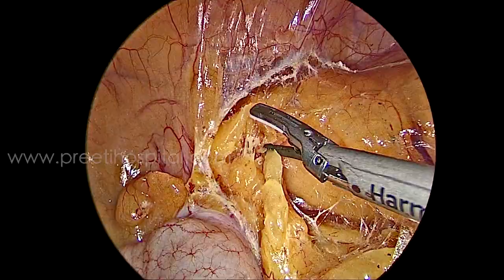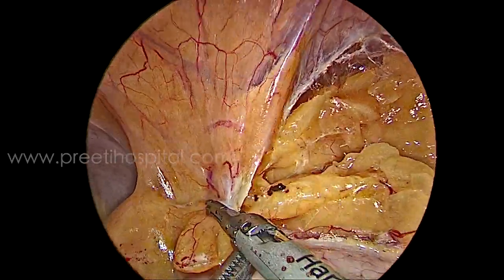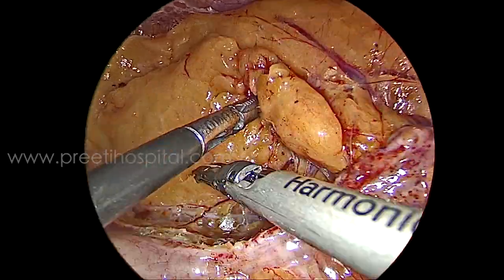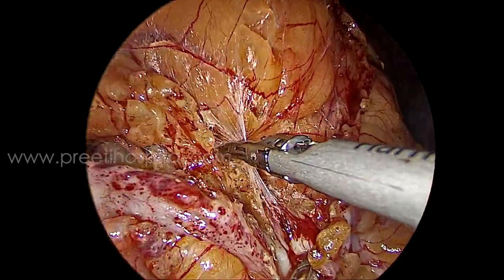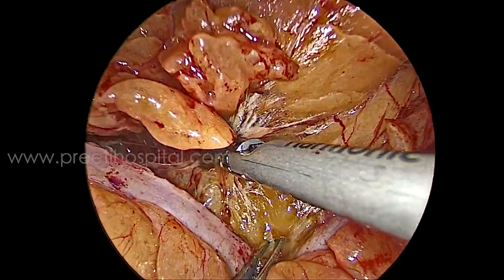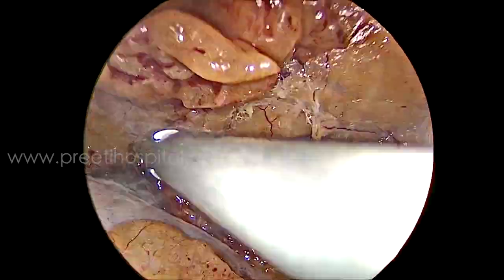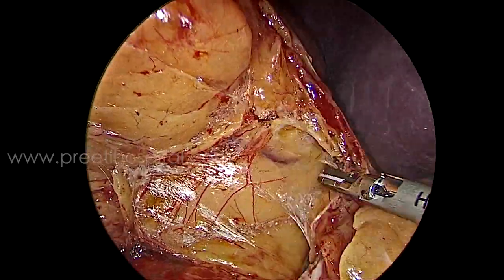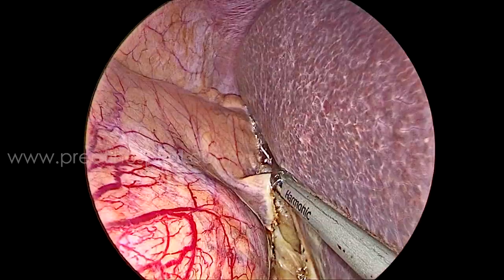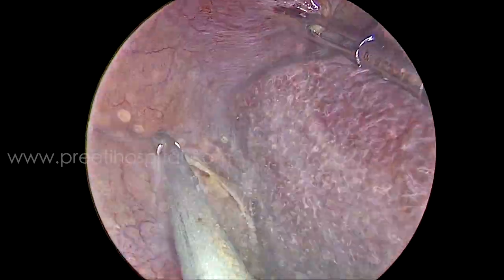When fat was separating, I thought I would mobilize the kidney very fast. There was loose areolar tissue, and similar loose areolar tissue will be there between the renal parenchyma and the fat — then you can strip off and divide up the fat. This is perinephric fat. What we are separating is Gerota's fascia and the fat of the mesentery.